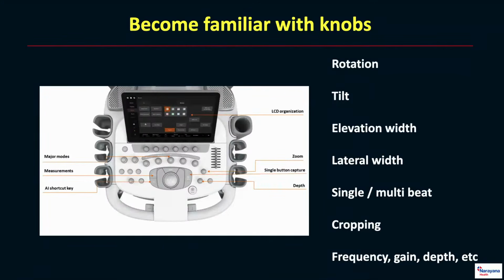And spend time with the machine. I always keep telling that the best friend for you is the machine, and unless you know how to develop a relationship with the machine, you're always going to have a problem. So know the machine in and out, know your knobs, and especially in terms of the 3D, there are a lot of knobs, and these are the knobs which are commonly used. Know each and every one of them and what value they bring, and when to use it. So spend time. Unless you spend time with the knobs, it's going to be a longer learning curve. You will learn, but it takes a longer time, and you will be lost for a longer period, I would say.